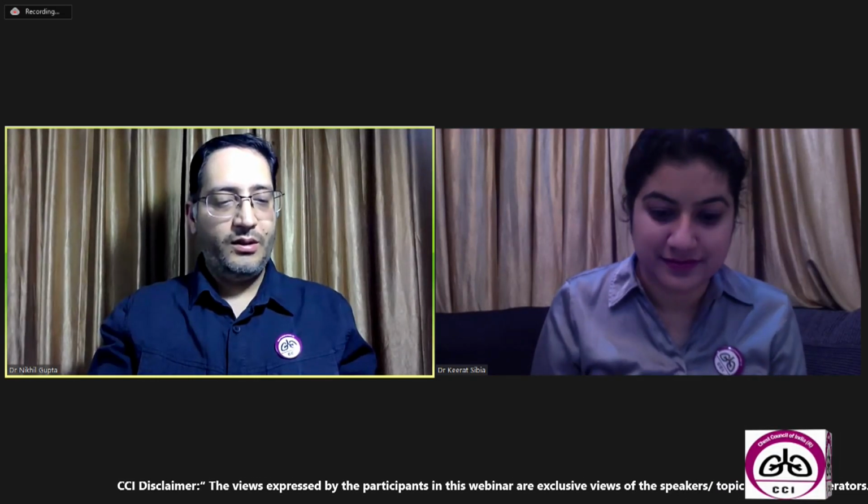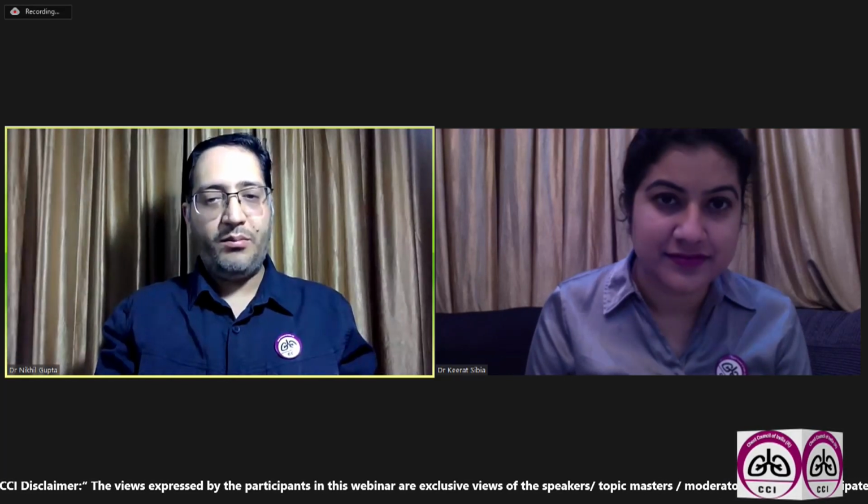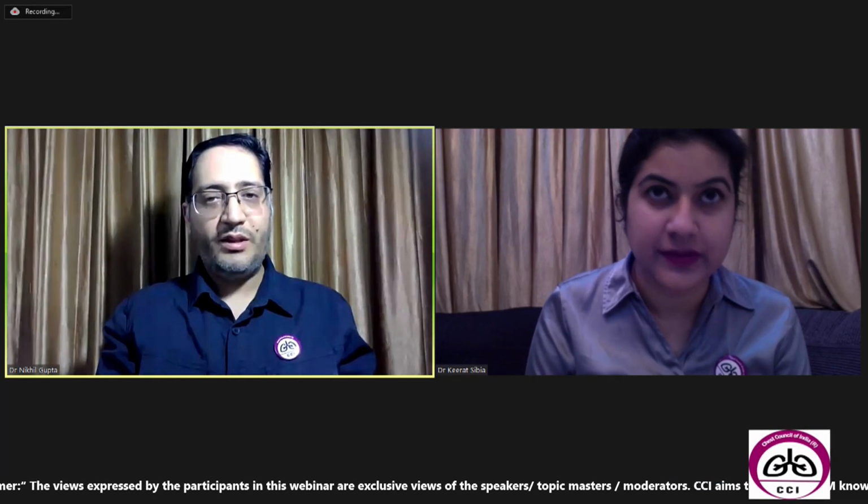Also, raised hemidiaphragm can also be there.